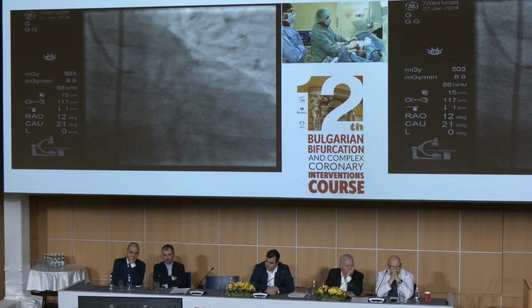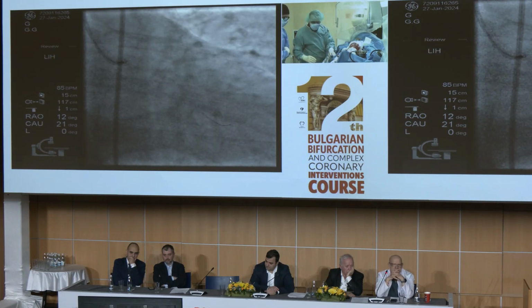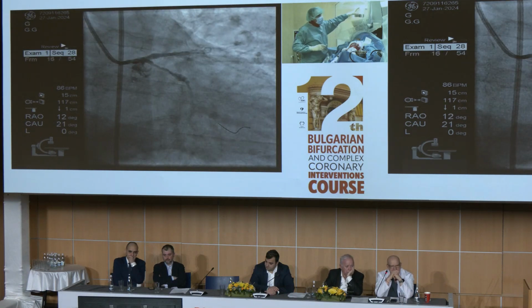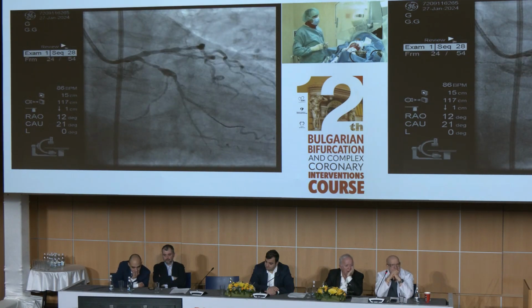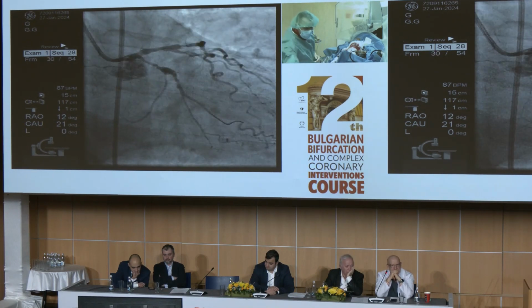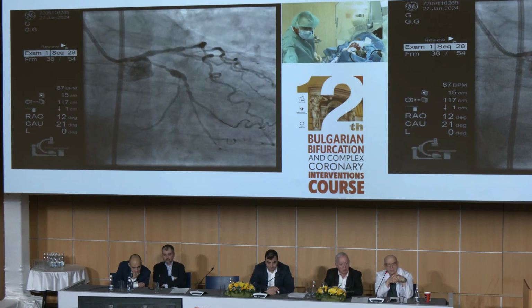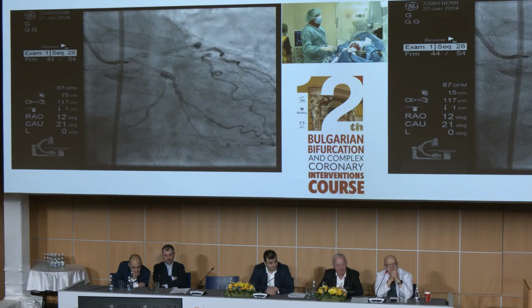And we should replace the result. I think it is quite good. Do you see it, Valeri? Yes. So we are going to exchange with the regular wire and continue with this vessel.